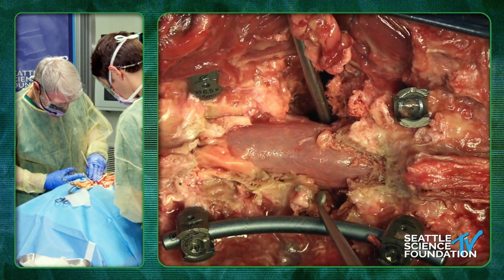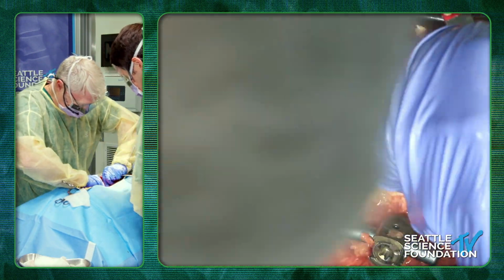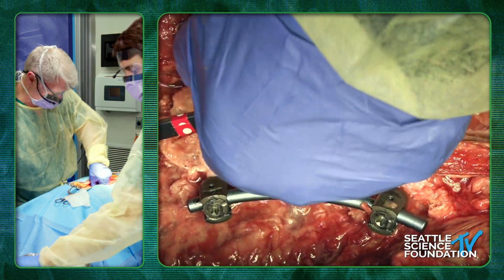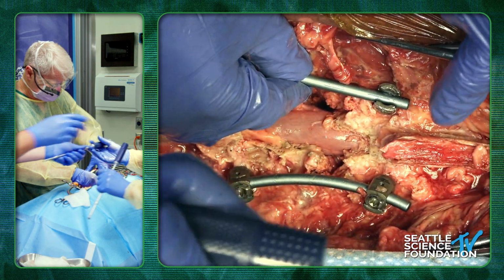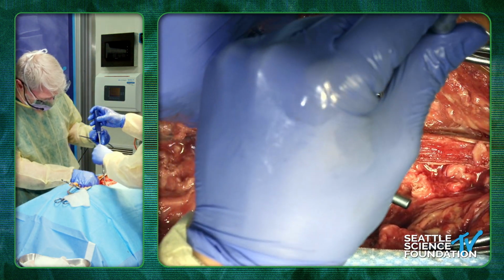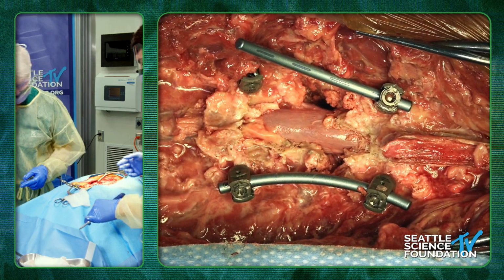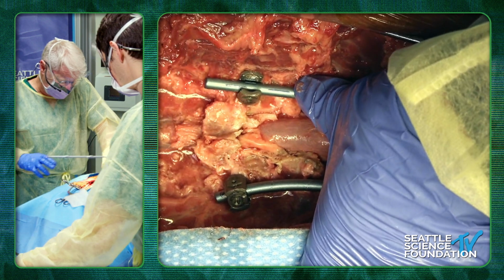So now it'd be time to close her down. You can see the osteotomy is all mobile now, and now we're going to be closing her down. So we just take our rod. So if I'm doing it from this, we'll put a set screw in here. Is there more set screws for us? Is there a rod gripper of some sort? A rod gripper or something? So, okay, I'll try here. Okay, put the set screw in.